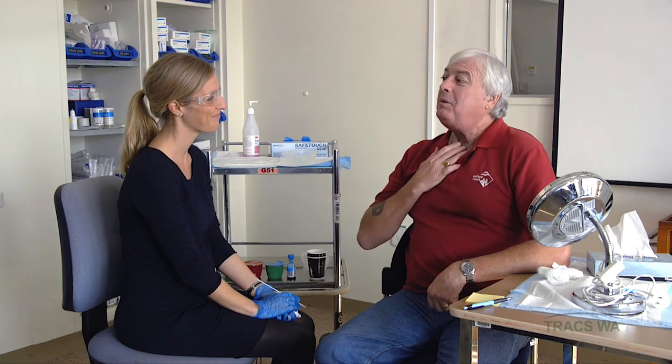I think we just needed to give your valve a bit of a clean because it had become blocked with some dried mucus or some phlegm or perhaps a little bit of food at the back of the valve had gotten stuck, but we seem to have gotten rid of that now and the airflow is going through really well. But I think we've solved the problem for today. Well, yeah, I got my voice back.